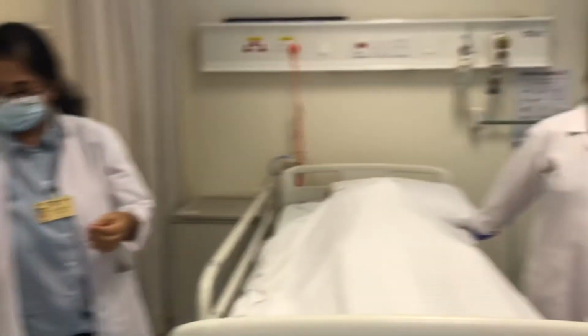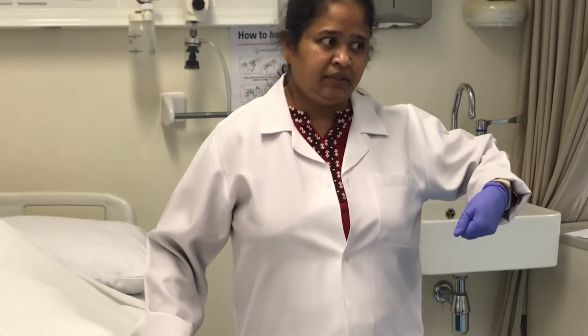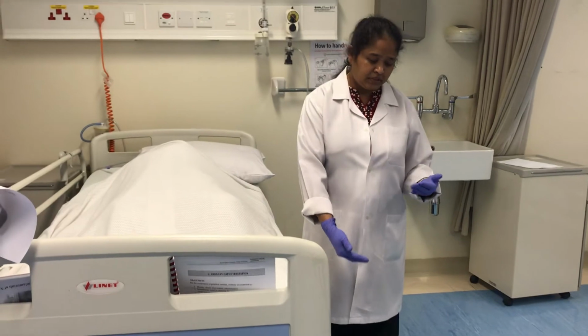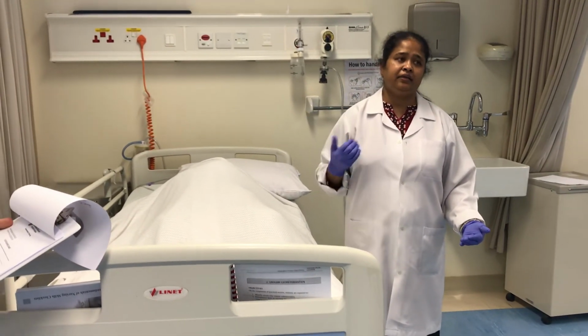When they are getting up or going to another place, they always want to carry it. It should never be held above the waist, which is a very, very important instruction we need to tell them, because reflux from the bag can go back inside and it can cause problems.